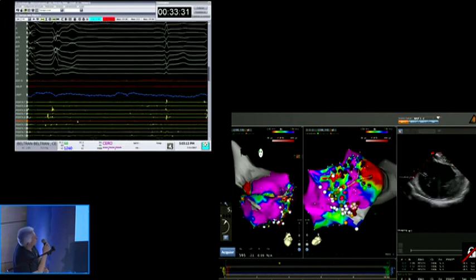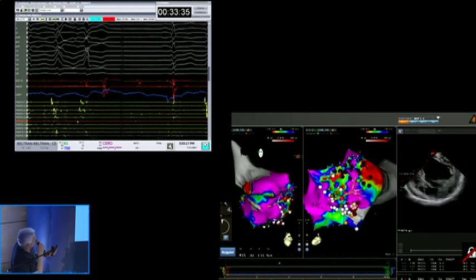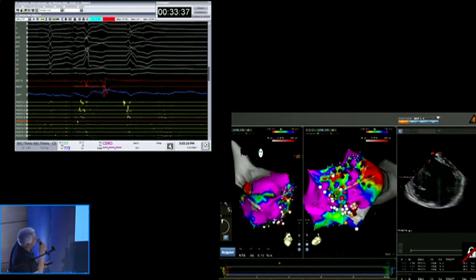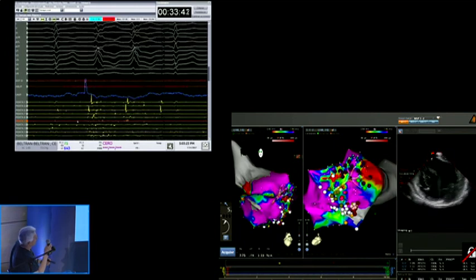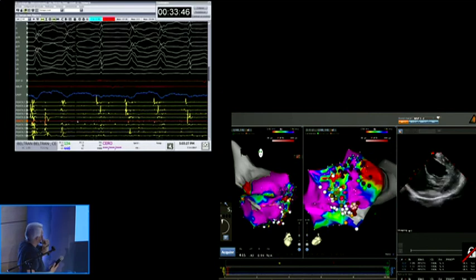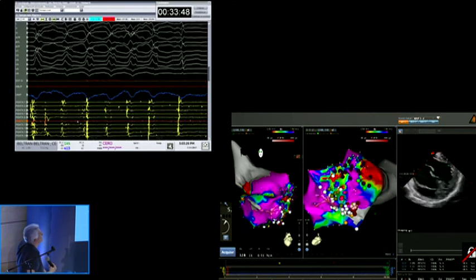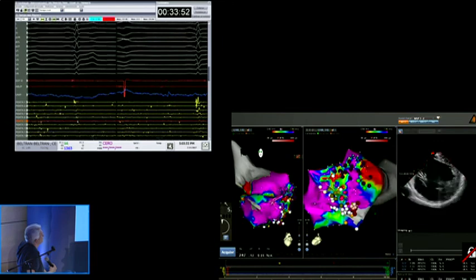Todavía no hago contacto ahí. Está floating. Estás enredado en la cuerda. Yeah, you got me floating. A ver, que me tengo que venir un poquito más septal entonces.